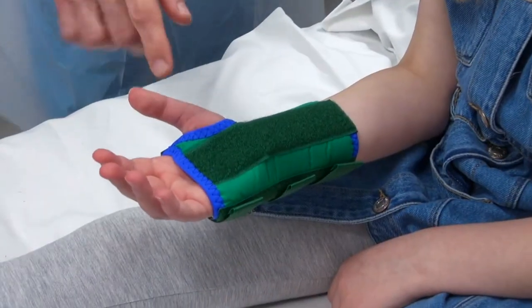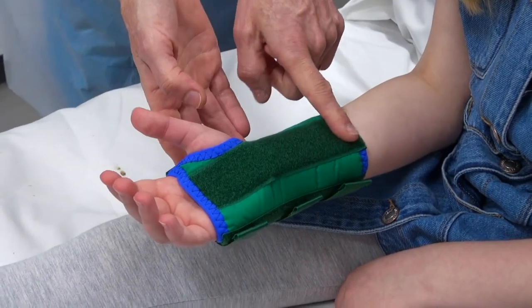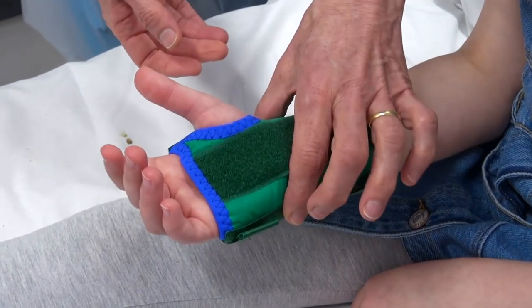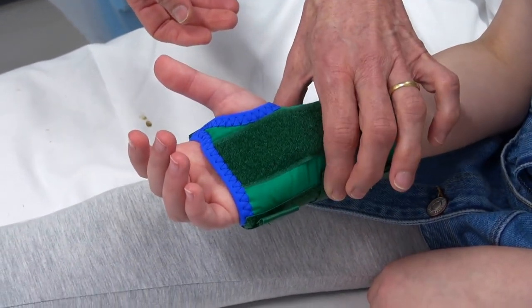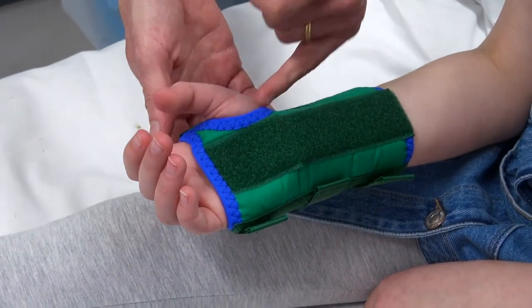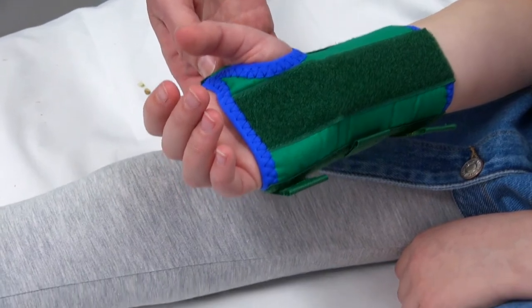So with this splint here, we have the metal bar down the front, so the curved bit needs to sit in the palm. We need to make sure the narrowest part is around the narrowest part of the wrist, and that the thumb is able just to move around and it's not rubbing around the thumb just there.